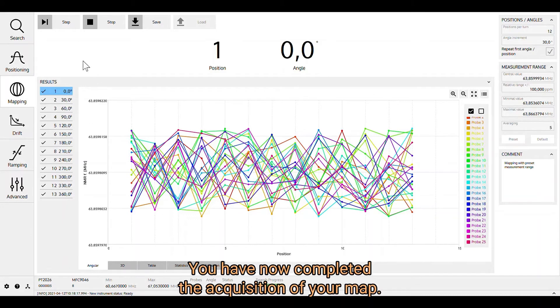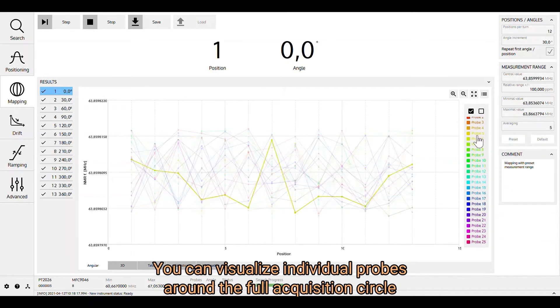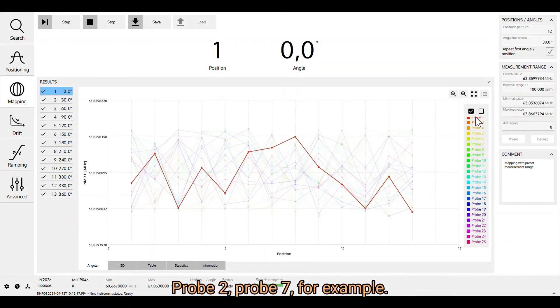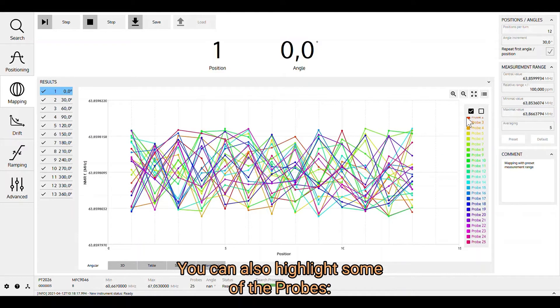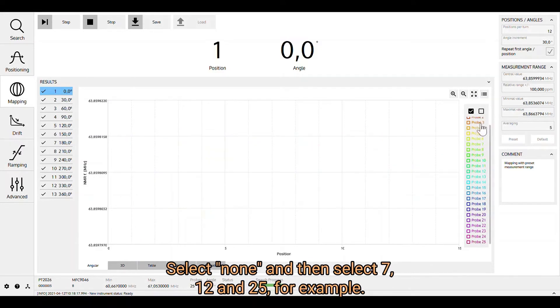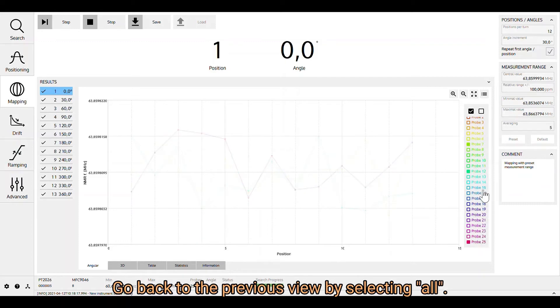You have now completed the acquisition of your map. You can visualize individual probes around the full acquisition circle by hovering the mouse pointer over the probe of interest — for example, probe 2 or probe 7. You can also highlight specific probes by selecting none, then selecting probes 7, 12, and 25. Go back to the previous view by selecting all. You also have the possibility to zoom in on areas of interest and zoom out.